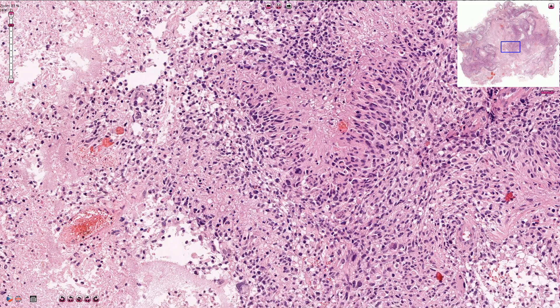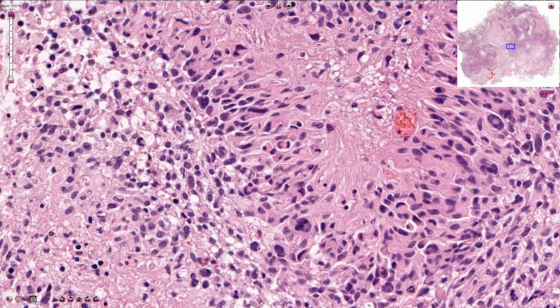This is perhaps a better example of palisading, with a linear arrangement of the cells around the necrotic area in the center. Apoptotic cells are very common — those are these hyperchromatic small round structures — and mitotic figures are quite frequent.